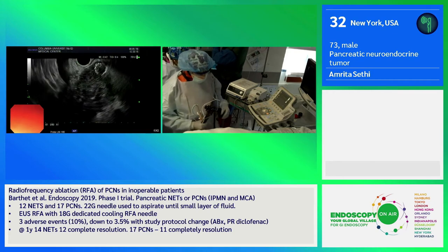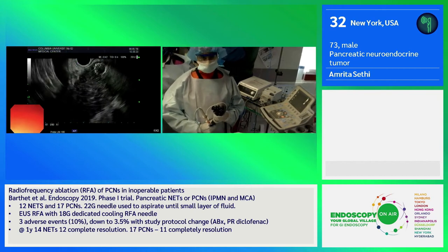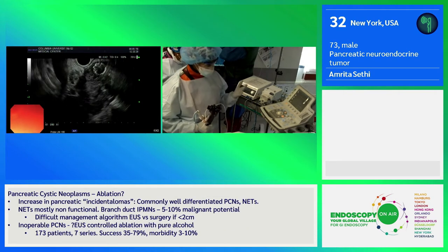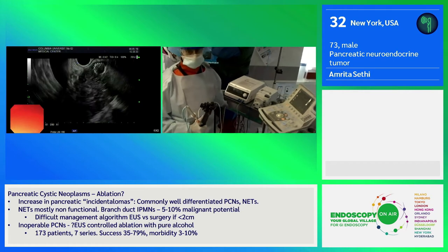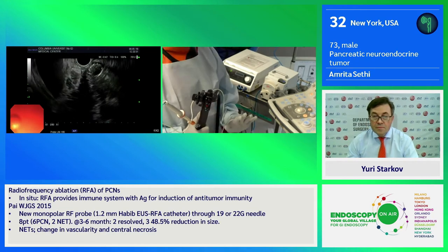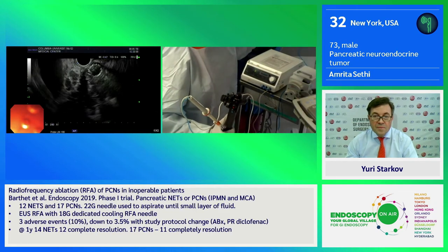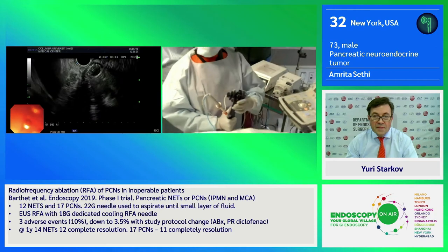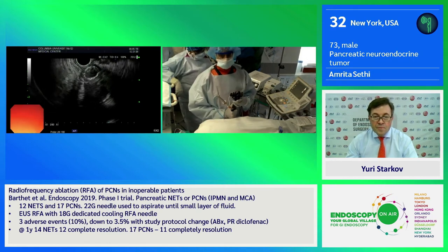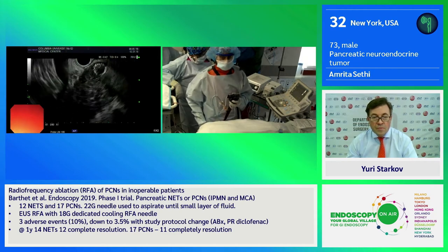We have here a Taiwu EUS-RFA probe. It is similar to an EUS needle — I will show a picture of the electrode after the procedure. It has a proprietary generator. This is monopolar energy, with two grounding pads on the patient. The needle is connected to the generator and also connected to an irrigation system. The needle is going to be continuously bathed in saline to allow for cooling during the actual ablation, prevent sticking of tissue to the needle, and allow for more continuous treatment.